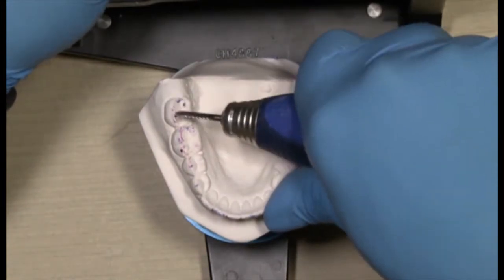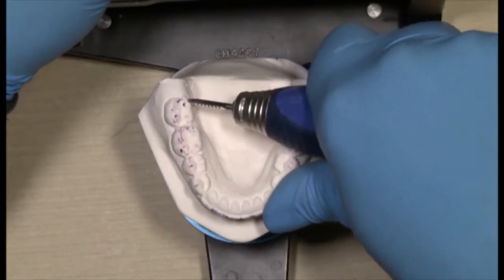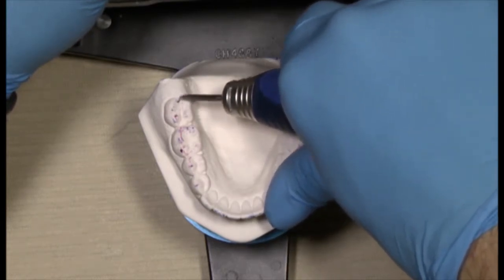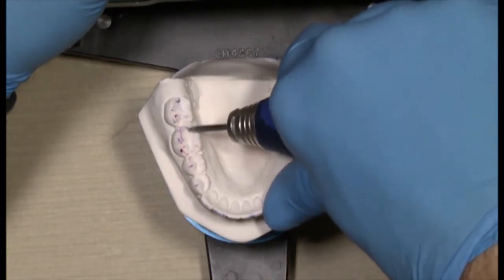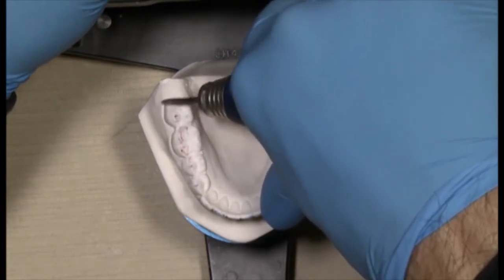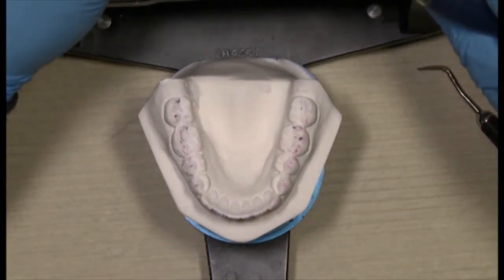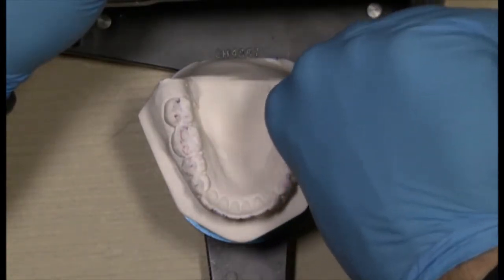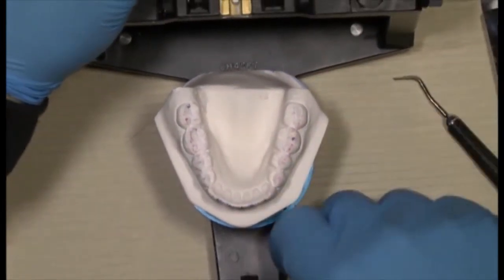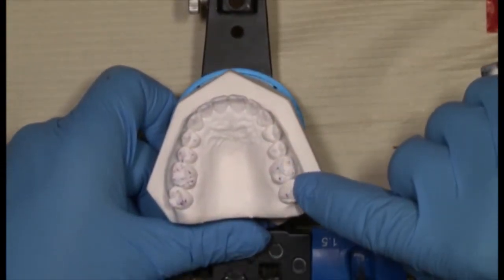If this was a crown that you just placed in the upper arch, and this was a large MOD alloy, this would be a distal lingual cusp that would be at risk to be fractured. So this, just take these away. All of these on the inside. Same thing on the outside. We're only trying to preserve what's on the cusp tip. That's why when the crowns come back and you don't really have cusp tips, they look really kind of fat looking or rolled. They're so much more difficult to work with in the mouth. This is what I want. I want to keep tips just like that.